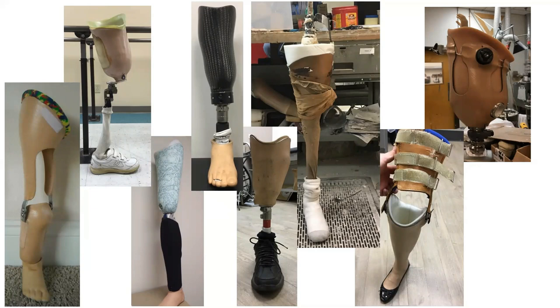So we need to think about what we're trying to accomplish. And we need to approach these differently as far as where we're applying material, types of resins we're using, what types of steps we need to do, the fabrication. So there's a lot involved.